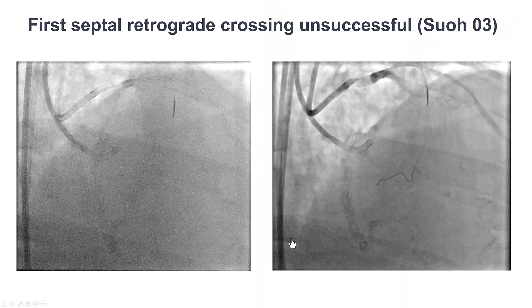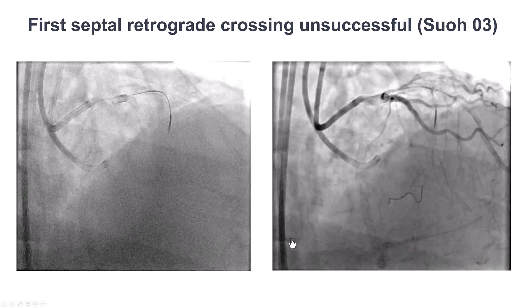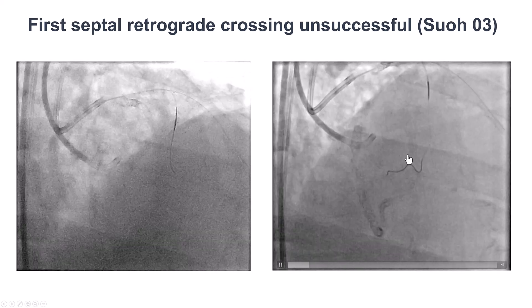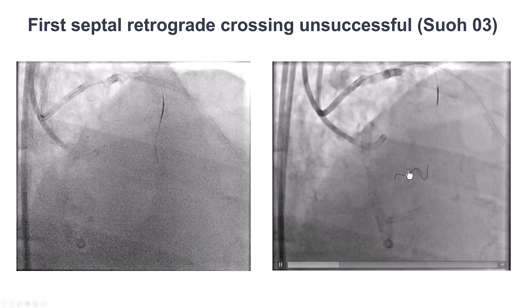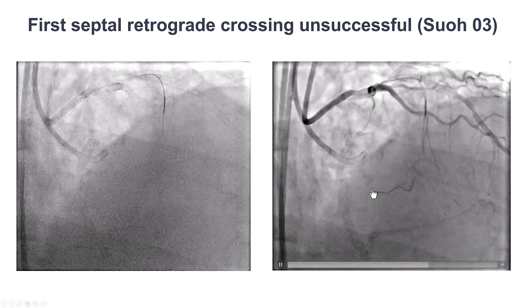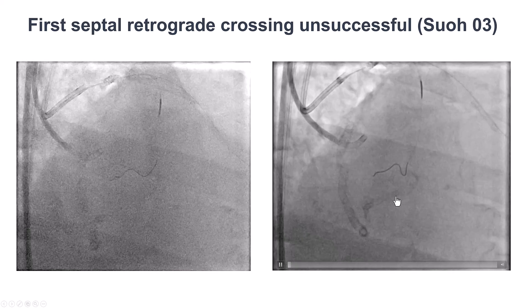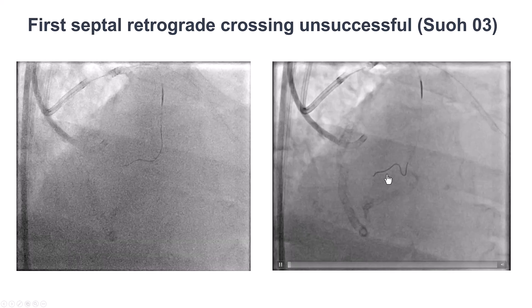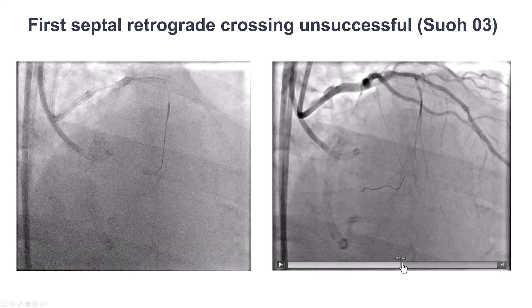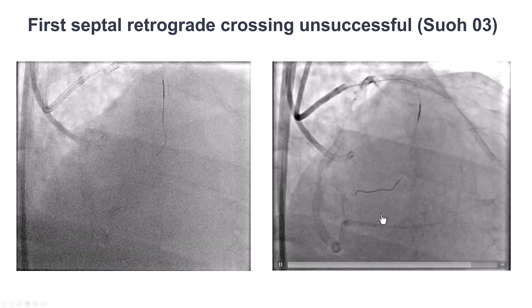We went back in and tried a SUO O3 guidewire that is very soft with a 0.3 gram tip. We made some progress and were able to advance it partially inside the collateral, but unfortunately, even after delivering the microcatheter further down, we were actually unable to cross all the way into the right coronary.